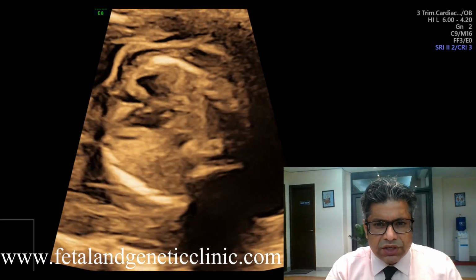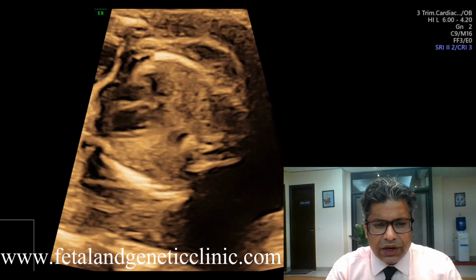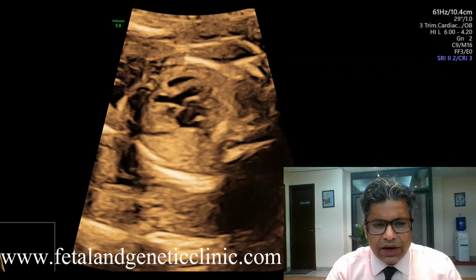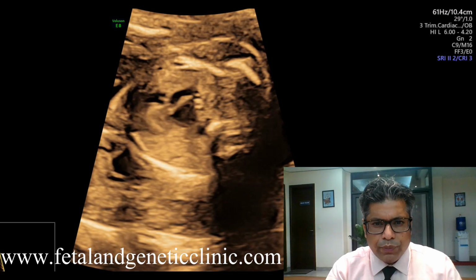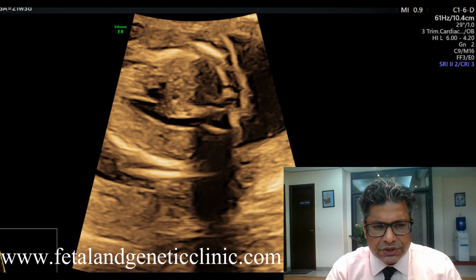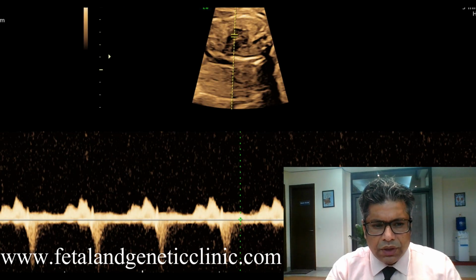इसमें right aortic arch का association काफ़ी common है. So we try to rule out the right aortic arch, and then the whole idea is to identify the pulmonary arterial stenosis and vis-a-vis the right ventricular hypertrophy proportionate to the pulmonary arterial stenosis, right? So इस case में at the moment what we are identifying is this is the TR of the heart.